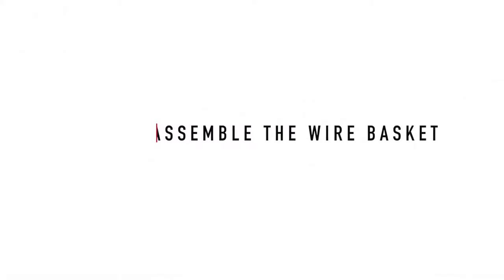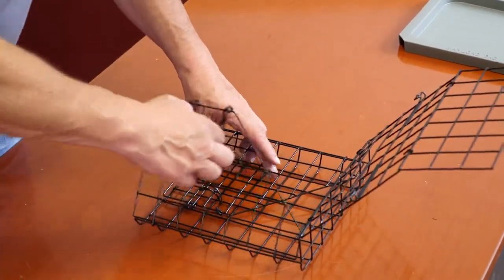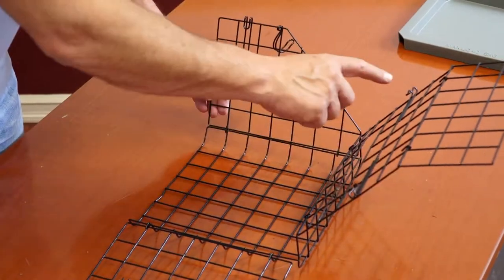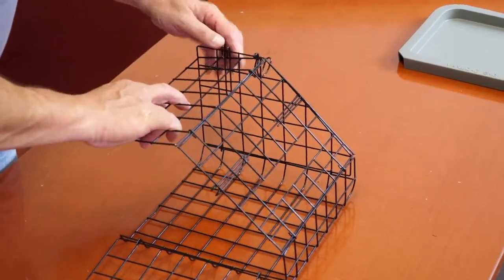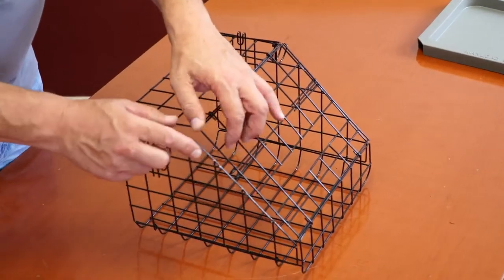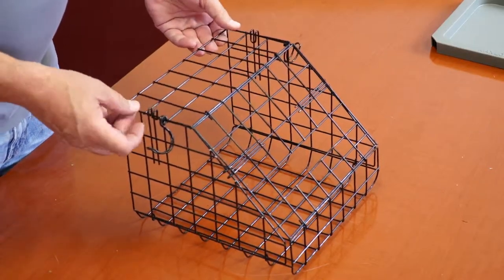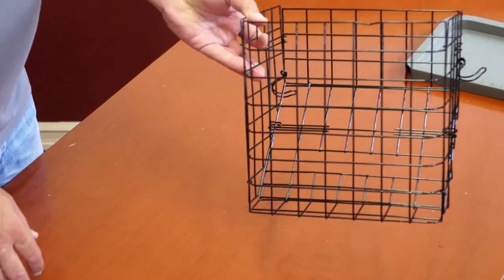Assemble the wire basket. Begin by unfolding the top and the side flaps. Bring one of the side flaps and the top flap back up and snap them together, first using the hook on the top flap and then the second hook on the side flap as seen in the video. Repeat the procedure for the other side flap. The wire basket is now assembled and ready to be installed onto the Rollator.